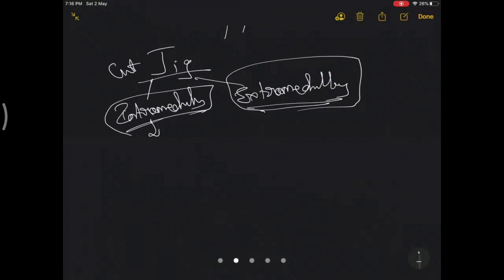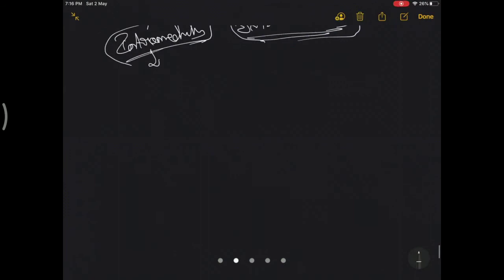To start with, most surgeons will take a proximal tibial cut first, and then the distal femur. You can do it otherwise also; there is no issue with that.